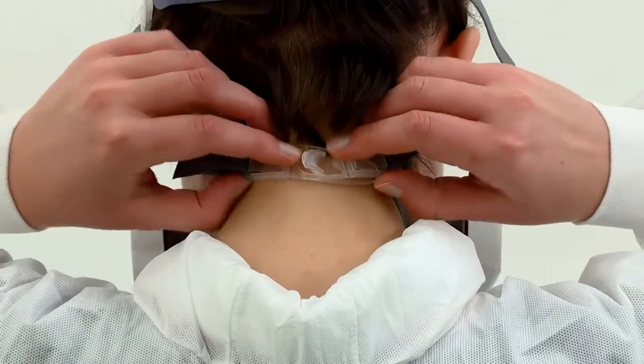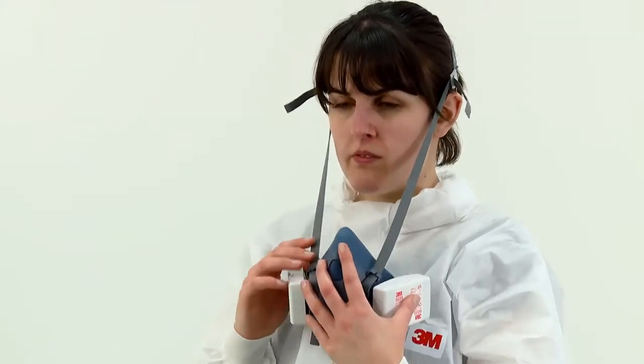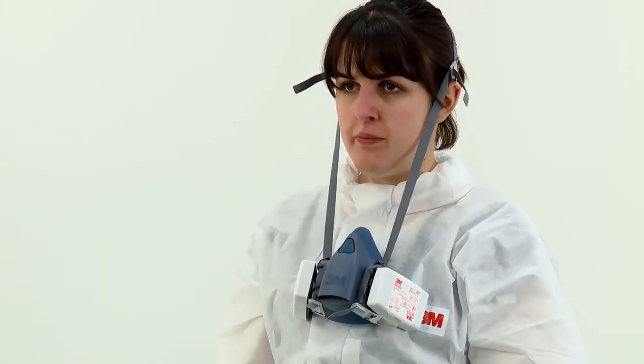The 7500 series reusable respirator may also be used in an optional drop-down mode. See instruction booklet for further details.